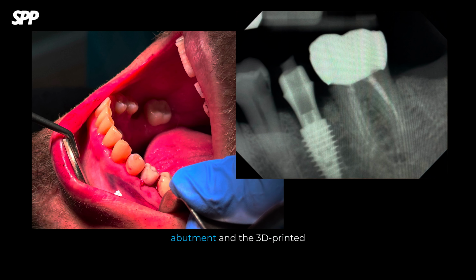The custom abutment was fabricated through the R2 milling center. The crown shade was not a perfect match. However, the fit was very precise. I did not need to adjust the contact or the bite.